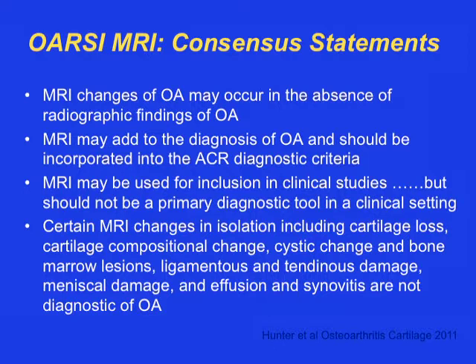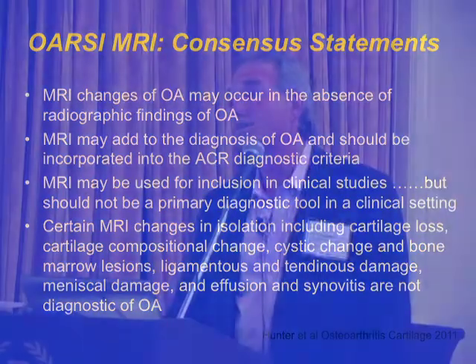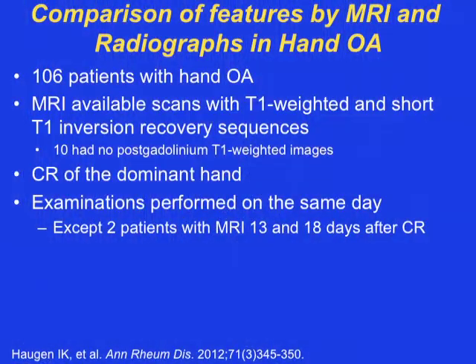but are diagnostic of what the patient has in your office. So forget about research. Patients in your office complaining of pain, and if you find out that they've got ligamentous or tendon damage, you've done them a lot of service. So I think from a rheumatology point of view, from the perspective of someone who does a lot of medical orthopedics, there is incredible value of being able to do this in your office and give patients the idea that this is your diagnosis. You've got a meniscal tear and so on and so forth.